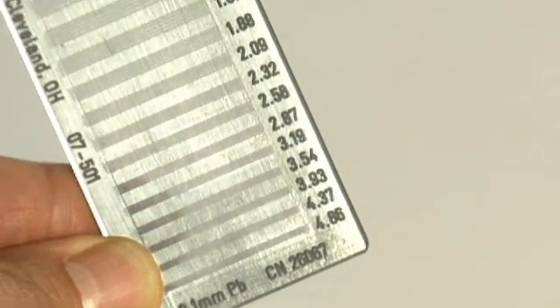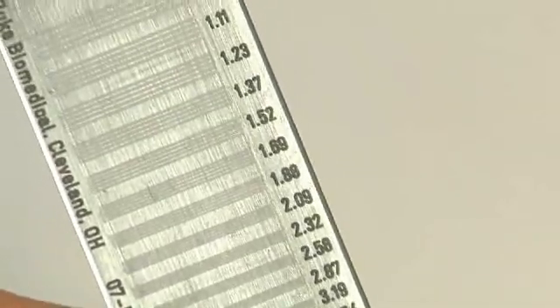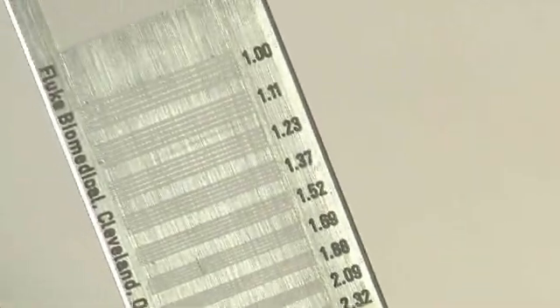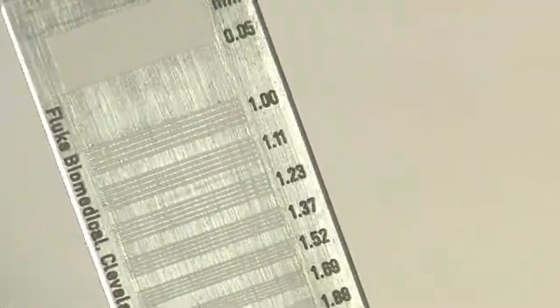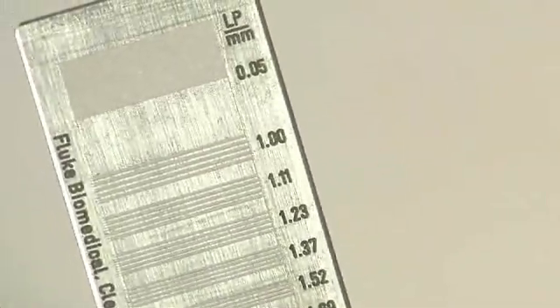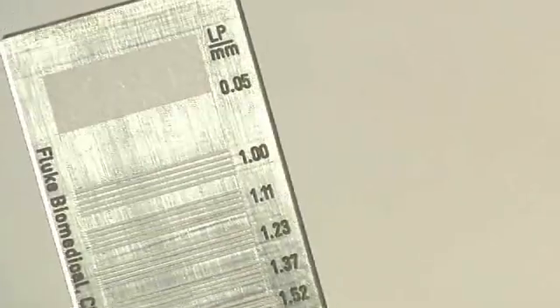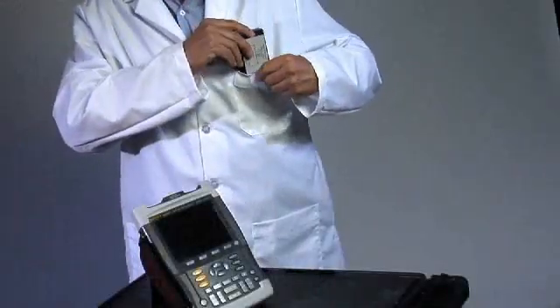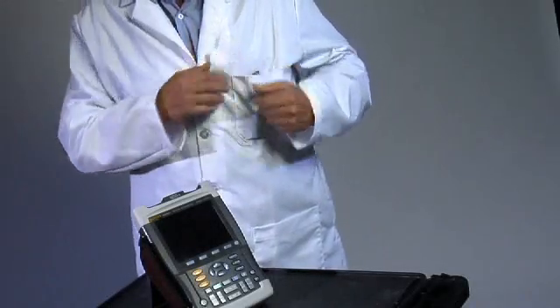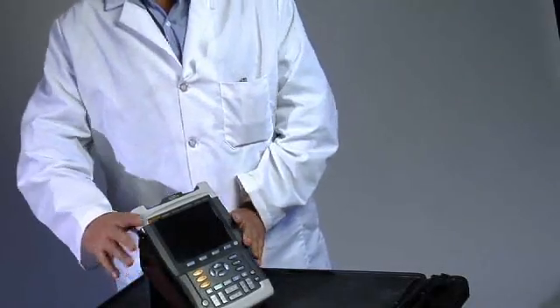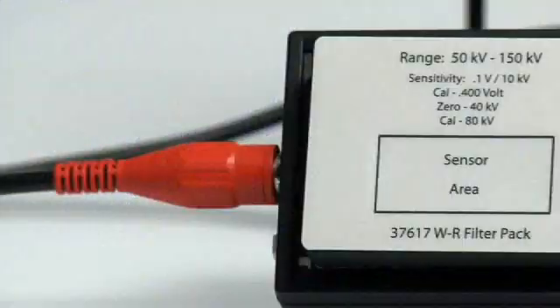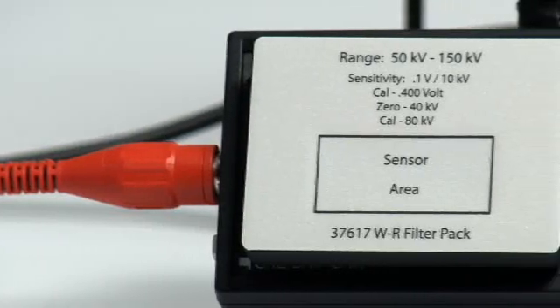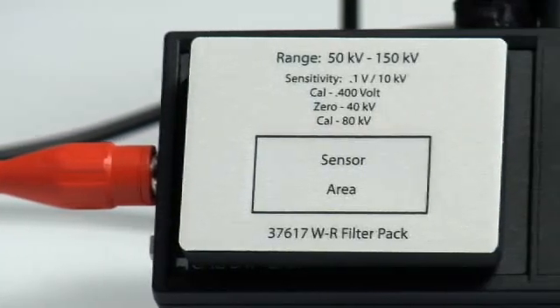A gradient on the line pair test pattern will indicate in line pairs per millimeter the value of the clearly visualized segment. Compact, convenient, accurate, and the Fluke reliability you can trust.